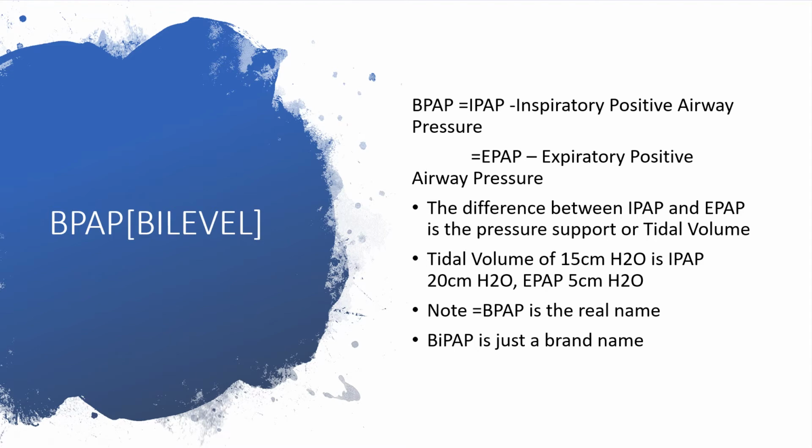We have to note that BPAP is generic, that is bilevel positive airway pressure, but many people will be familiar with BiPAP. BiPAP is just a brand name, and the company is so fortunate that many people are familiar with that, BiPAP.